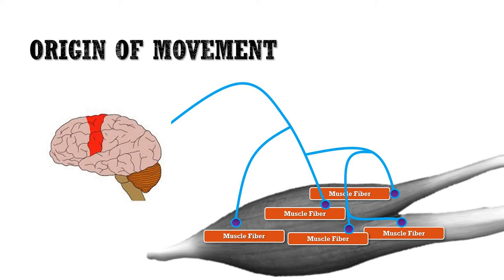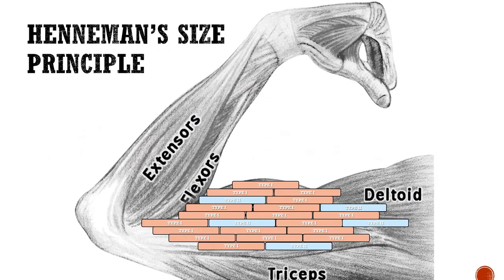So that's just a very basic overview, a recap of some of the principles of what we're measuring here with EMG. But again, just to reiterate, not measuring force, measuring muscular effort, if you like, or neuromuscular activity would be a better way of phrasing it.